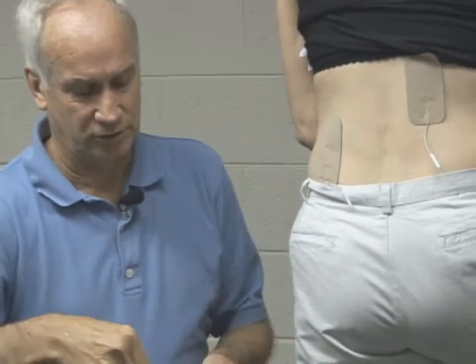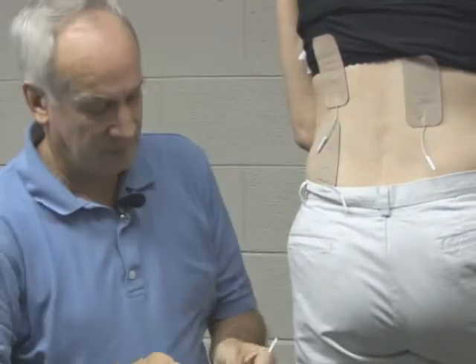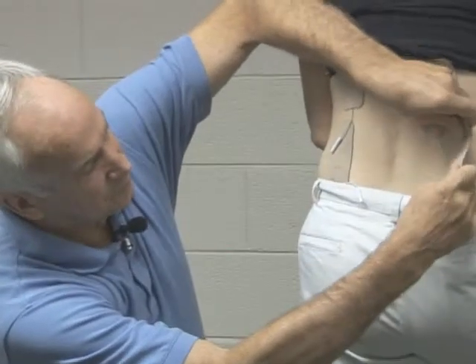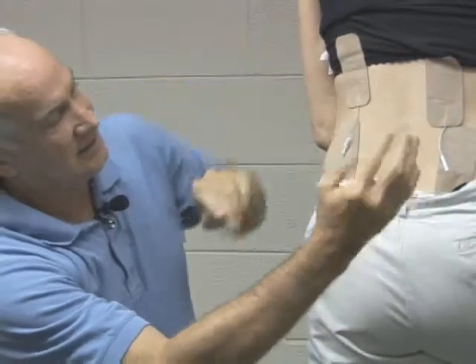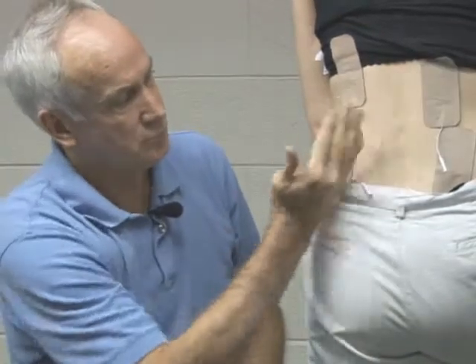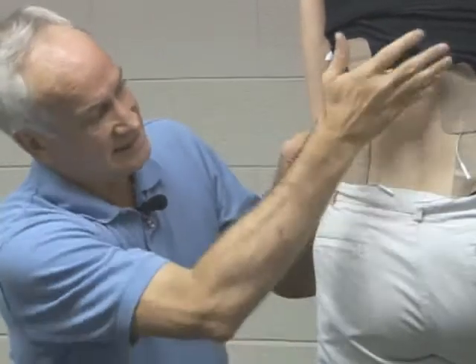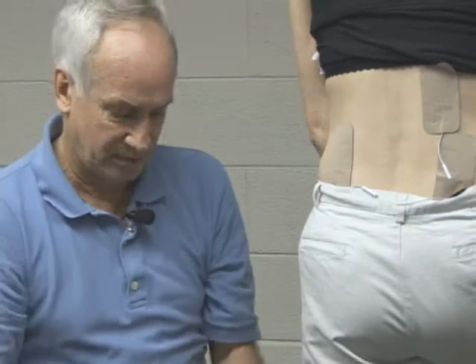Then I take my other two electrodes and put one on the top left, and take the other one to the area where she's feeling the pain — the bottom right. I put that electrode there and plug in the cables. When the Infrex Plus comes on, all of the area where she's feeling the pain — 8,000-plus times a second — is stimulated. This is an example of what we call the crisscross, which is the most common way people use it to get results.